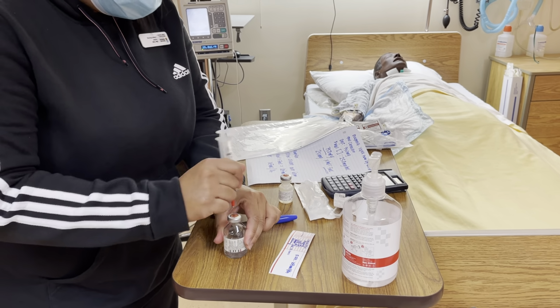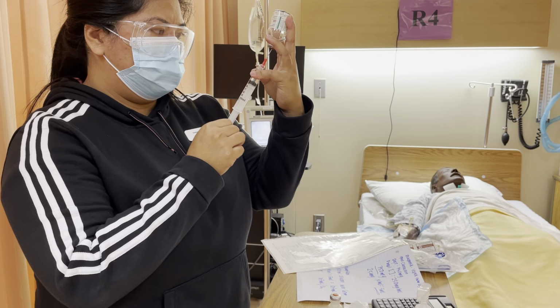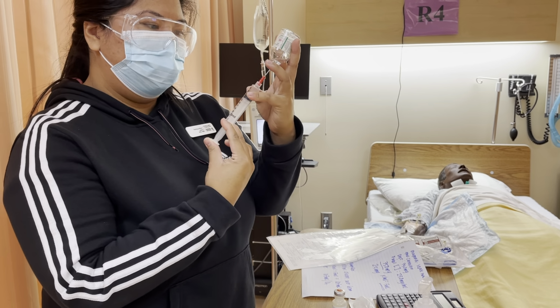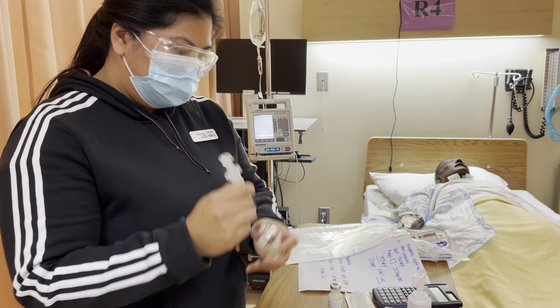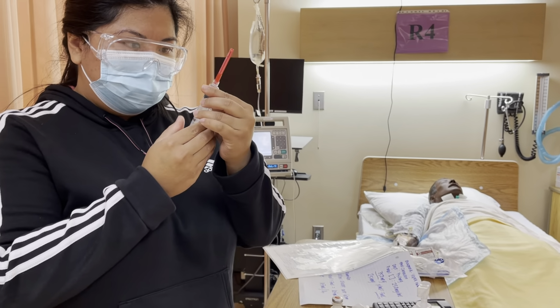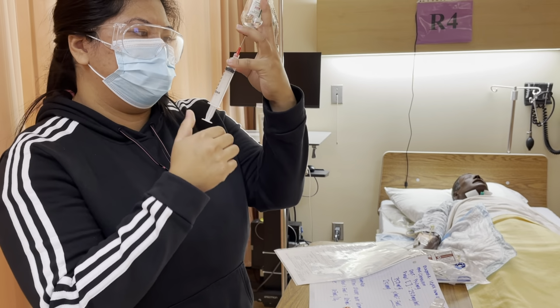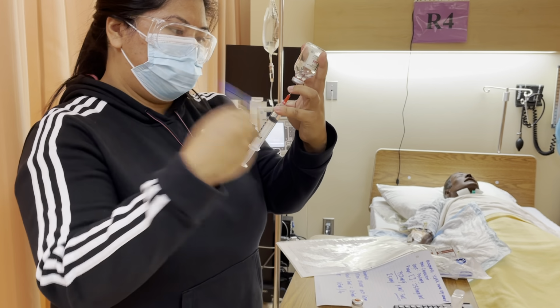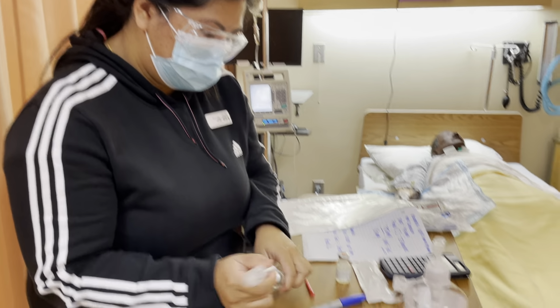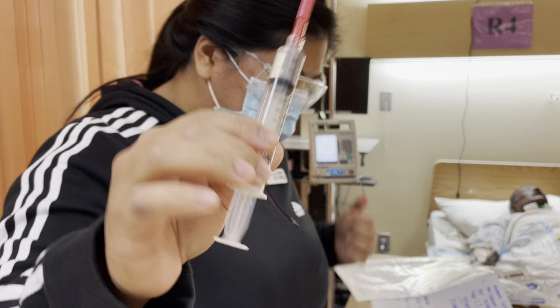We'll tap to get rid of the air bubbles, and then make sure we have the correct volume. Set this to the side for now. I'm just going to roll my vial, making sure everything's combined and that there's no sediment. I don't want to get any sediment sitting in my vial. Because I did touch it, I am going to clean it again for 30 seconds, and let it dry for 15. So that's ready. Because we need a dose of 750 milligrams, and we have a concentration of 250, you can see that I have 3 ml in my syringe.